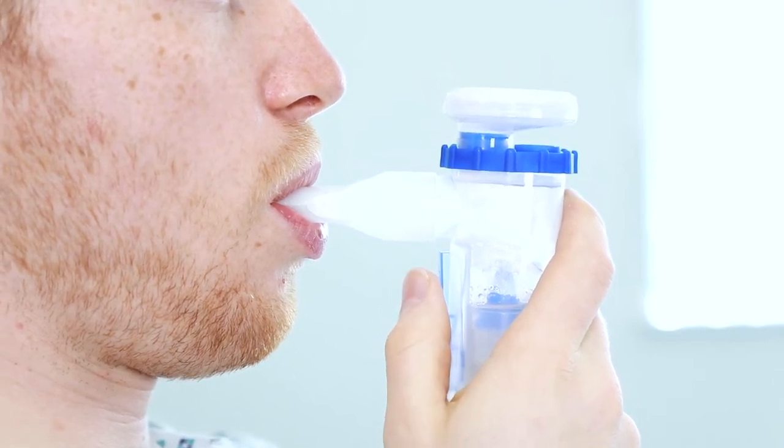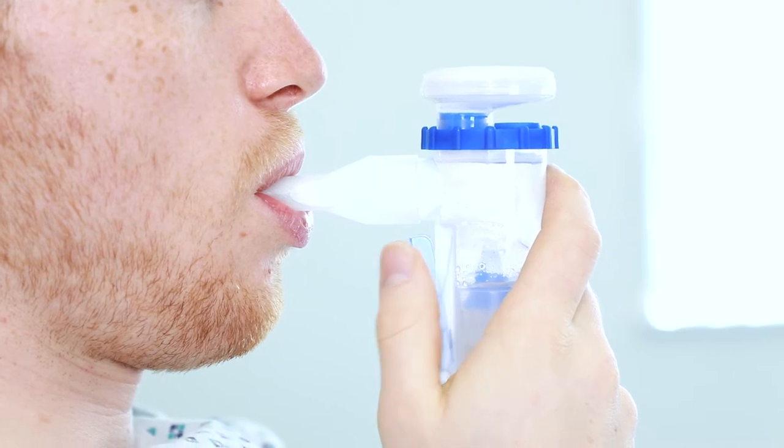At the end of a deep breath, release the trigger to stop the mist. Exhale through the nebuliser. This filters out exhaled medication and microorganisms.